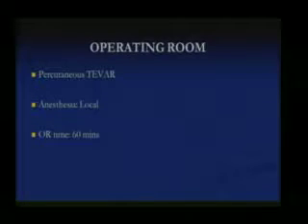This case I did discuss with cardiology, with the trauma team, and with the patient and the patient's family. He's extremely high risk because we have to have good control when we deploy the stent graft. We have to make sure the patient holds the breath so we land it exactly where we want to, because we don't want to land it on the subclavian or the innominate. But given the injury and given his comorbidities, we decided to perform the procedure under local anesthesia.